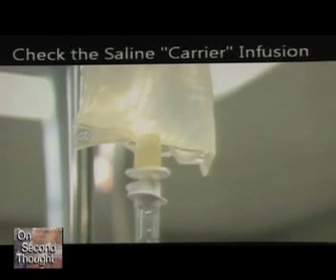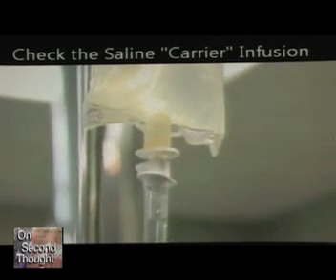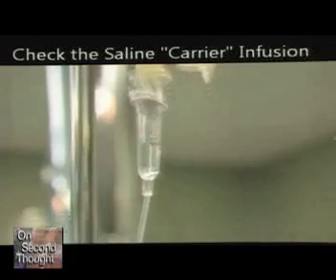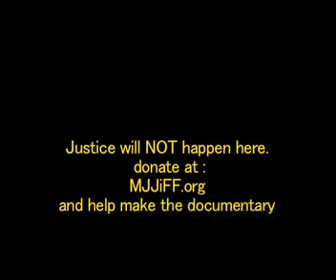Remember, I pulled this little white tab off and showed you the hole. This is the white plastic that's shoved through that so that this bag of saline infusion will drip into the patient. And you can watch it dripping by seeing the drops right here. You actually can see that it is running. Please continue. And then it comes down.